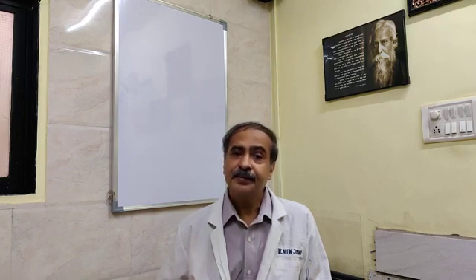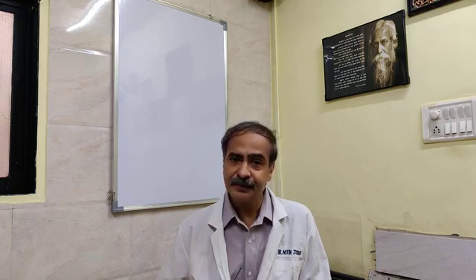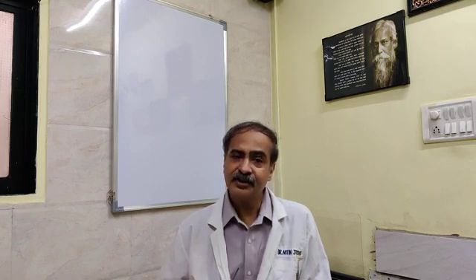Normally the main blood supply to the prostate is from 5 o'clock, 7 o'clock, 1 o'clock and 11 o'clock. At 12 o'clock position, adenomatous tissue is minimal, the capsule is thin, and periprostatic venous plexuses are close to the capsule. But at 6 o'clock, because of the posterior commissural hyperplasia, there is significant adenomatous tissue between the bladder neck and capsule.